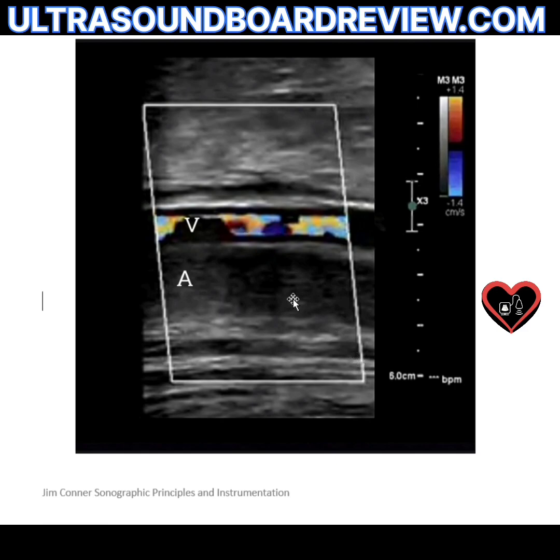How do you fix this image? Keep in mind: there's no color Doppler in the artery, but there is color Doppler in the vein with aliasing.